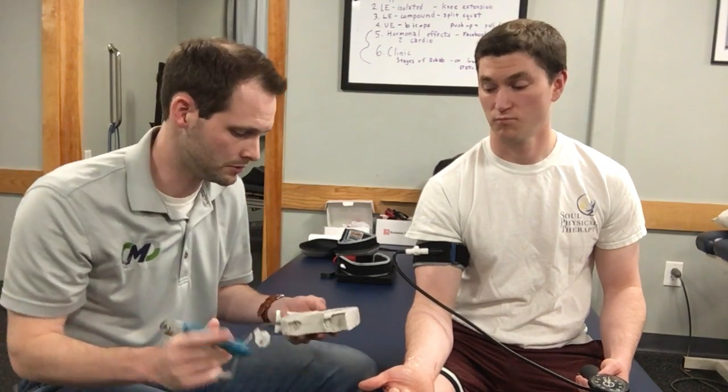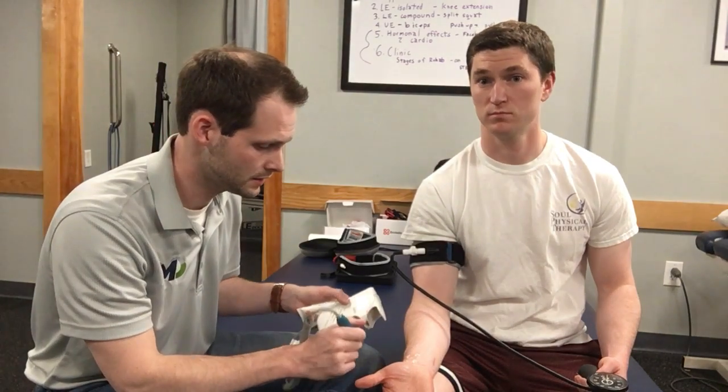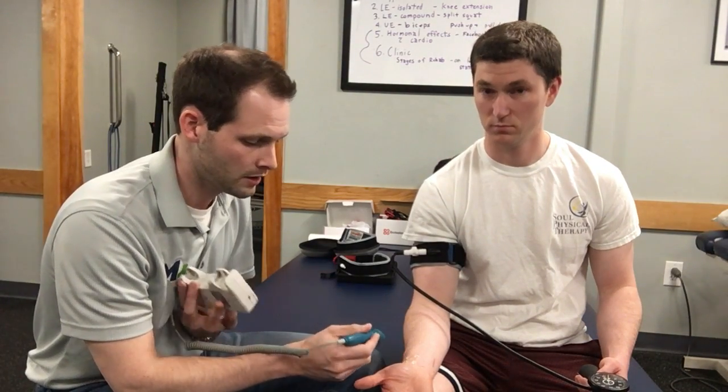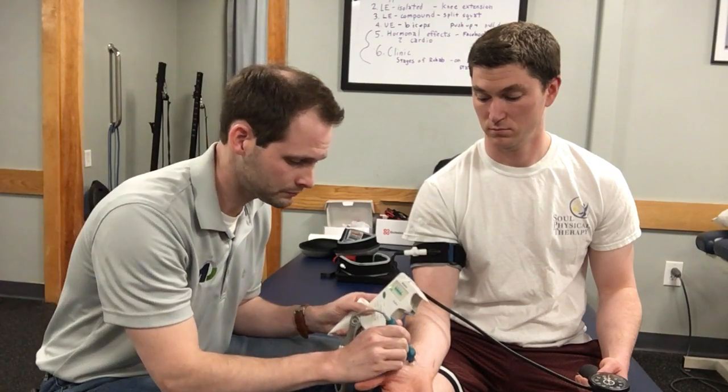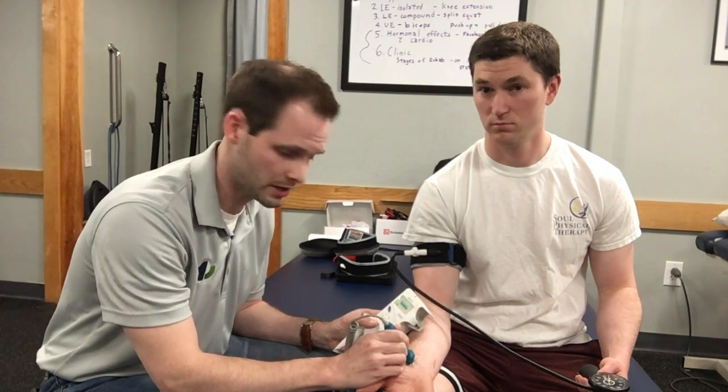What we can do is simple. I've already put some ultrasound gel on Andy's arm here. We're going to look at the radial artery — you can also look at the brachial artery in the upper extremity depending on the individual. When we turn this on and turn the volume on, hopefully this comes through on the video, but you can start to hear the Doppler ultrasound picking up the blood flow.